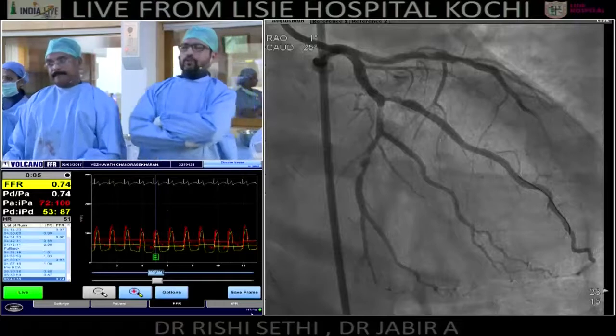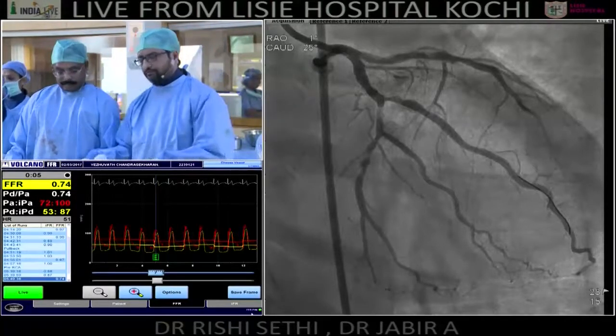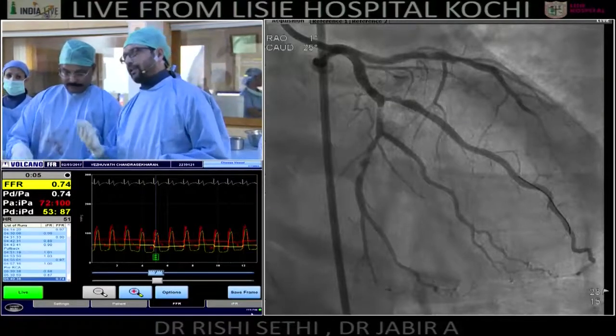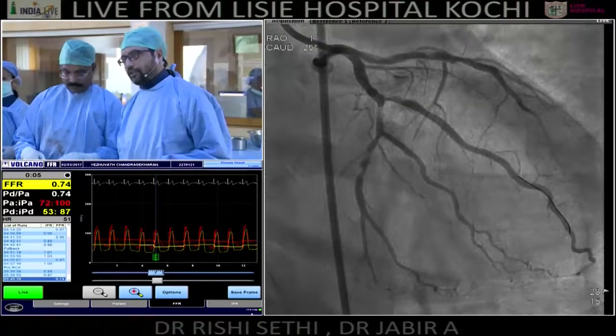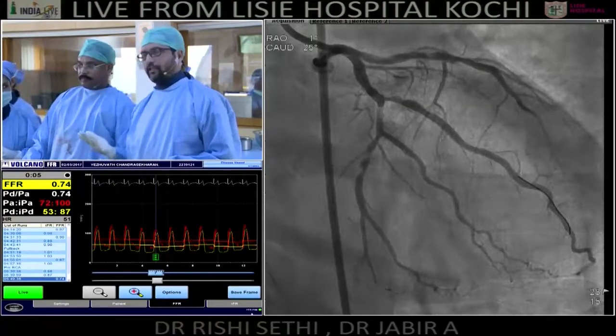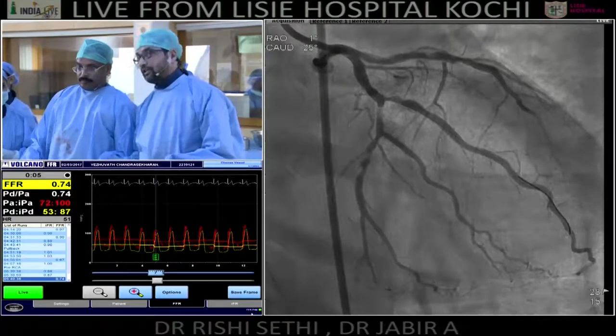Okay. So, I believe there was... what do you say? I mean, it is definitely a classical case of everyday lesions that we see, and we are really open to all sorts of suggestions and taking a decision. Heavens are not going to fall if you don't stent it either.